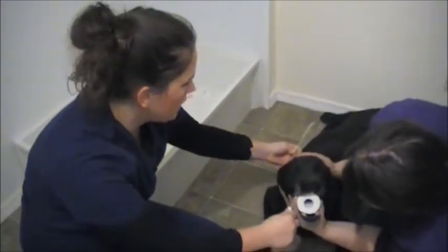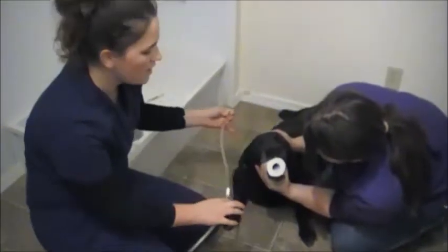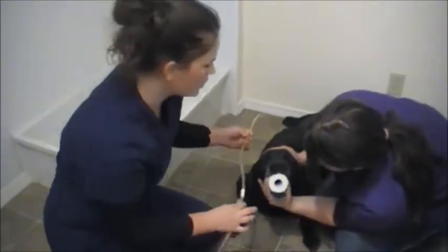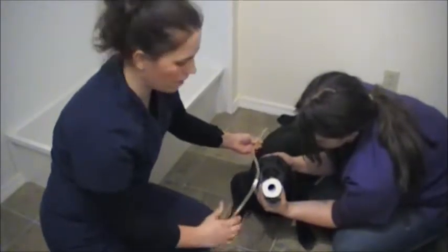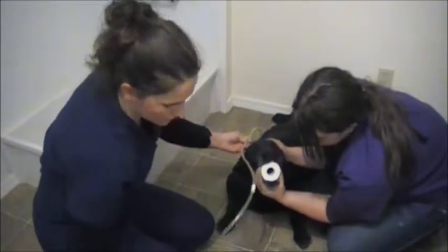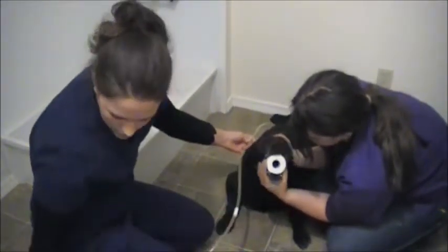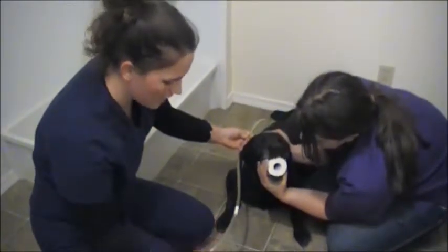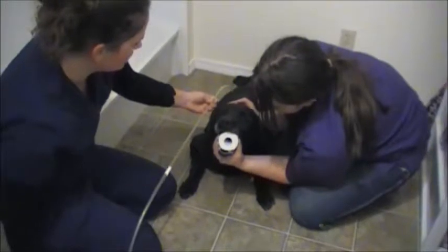So when the tube is placed into the stomach, you would then inject a small amount of sterile saline, 3 to 5 mils of sterile saline, and this would indicate if the tube is placed correctly where it should be in the stomach. If it's not, she will cough and it'll sound like water in the lungs, and that's how we would know. And then if it's placed correctly in the stomach at that point, and she's not coughing it up, but it's actually in the stomach, we could then inject the medication into the end of the tube for whatever medication that she needs given into the stomach.